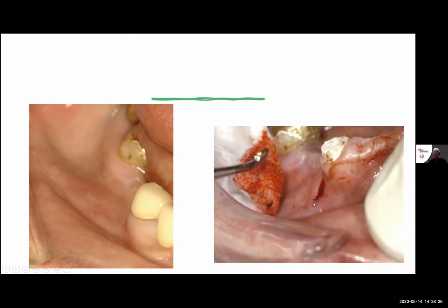And this incision is made so that it is big enough that you're going to be able to get instruments in. And I'll show you also the bone carrier that I use. It needs to be large enough to do that. Typically, that incision that's made is about 10 millimeters in length, 10 to 12 millimeters in length. And that would be long enough that it would enable you to get instruments in, and then also enable you to be able to get the bone graft and particulate in.